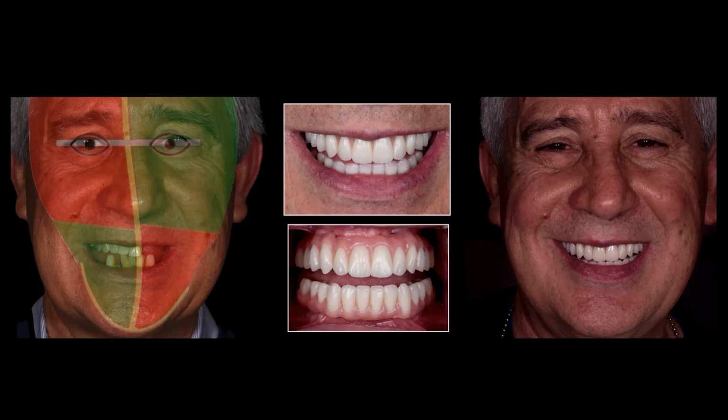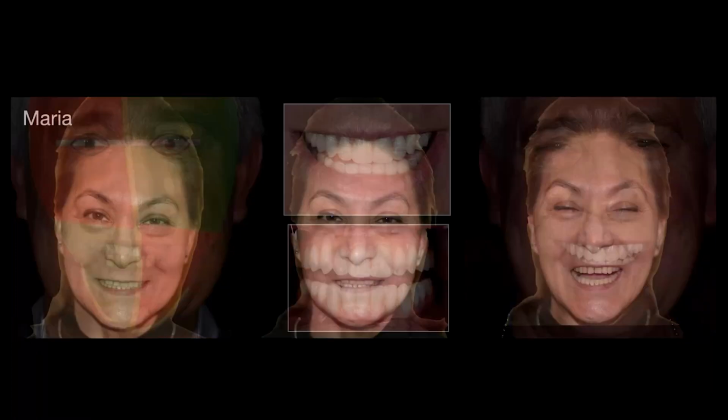And again, just to go back, look at the interpupillary line. You can see the bright spot there and the bright spot there. And you can tell that he is much more raised on his left side than on his right side. So always the same for me over and over again.